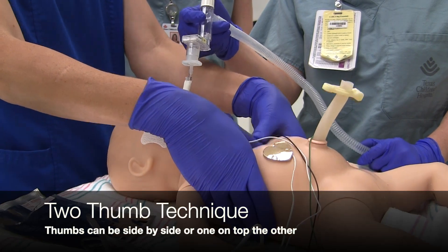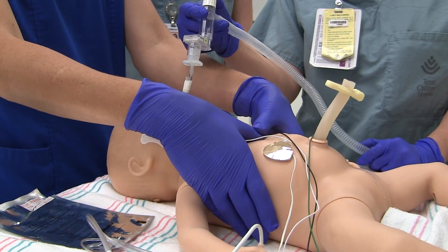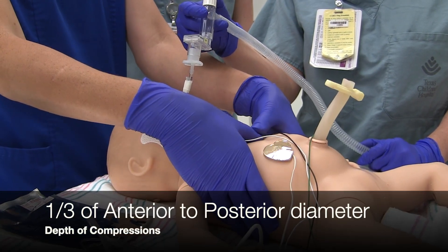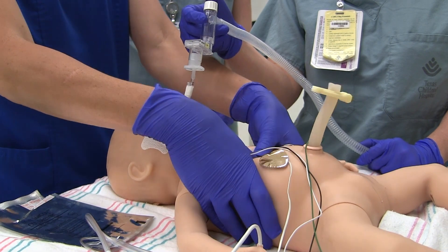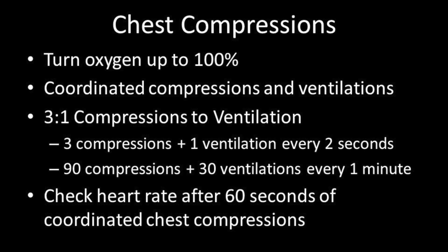Chest compressions will be done from the head of the baby. Place both thumbs over the lower third of the sternum. Press down to compress the sternum and chest wall one third of the anterior-posterior diameter. Be sure to completely release pressure between compressions without lifting your thumbs off the chest wall. When starting compressions, turn up the oxygen to 100%. Compressions in neonates are always coordinated with ventilation in a 3 to 1 ratio every 2 seconds — equaling 90 compressions and 30 ventilations per minute. Continue coordinated chest compressions for at least 60 seconds before pausing to check the heart rate.